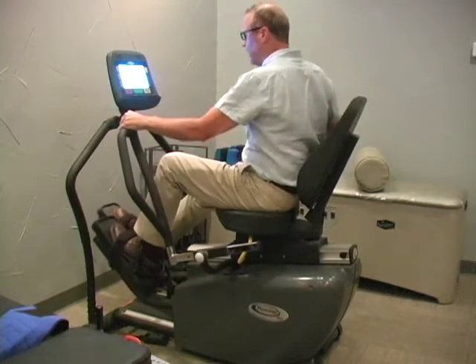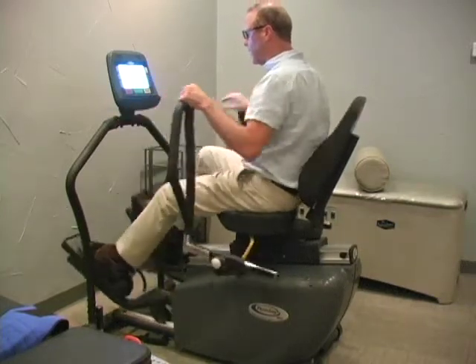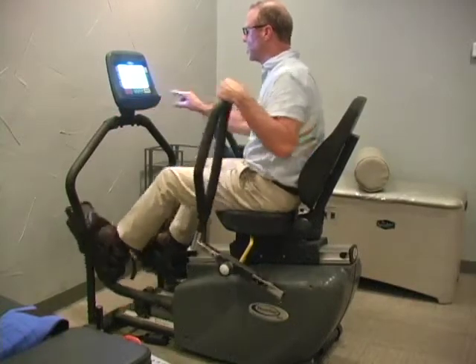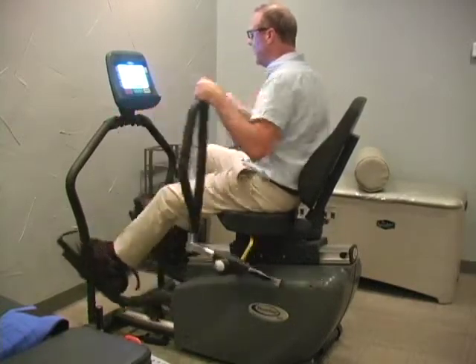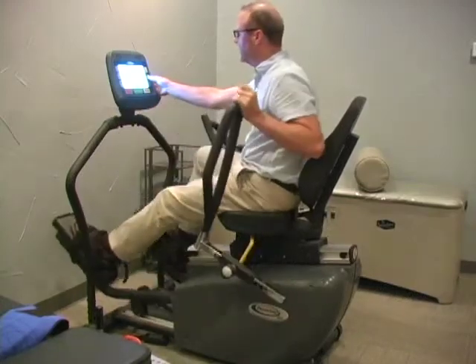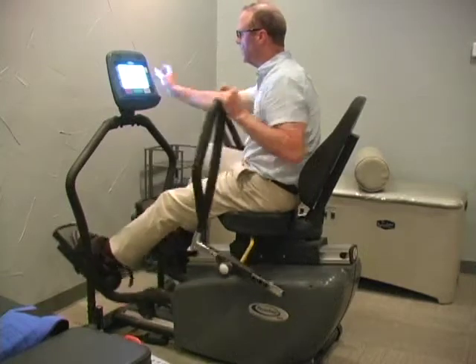Once you begin moving, the screen will illuminate. Touch Quick Start, and then to keep it simple, touch the Plus, which will increase the level of intensity.